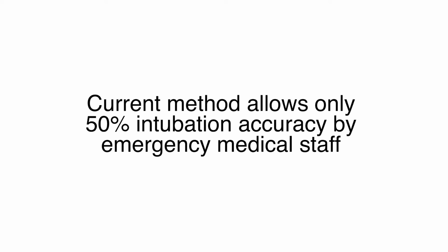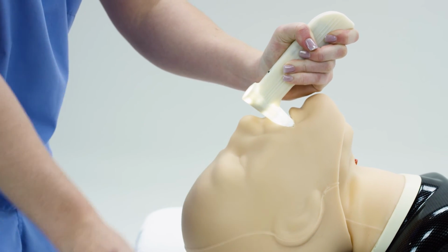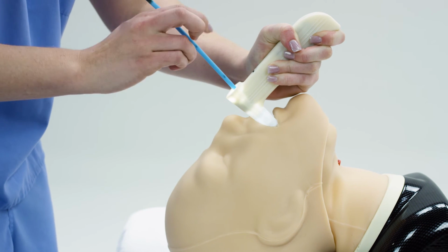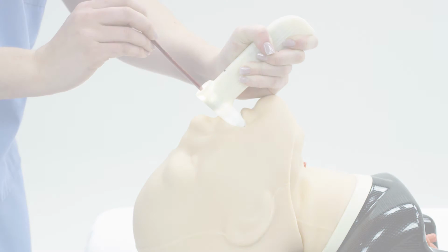in or outside of a hospital. Studies have shown that basic emergency medical staff intubate and place the tube in the correct position 50% of the time. Learning to intubate is not easy, and when the situation becomes difficult, such as with morbidly obese patients or after trauma, oftentimes very inexperienced people are called upon to perform intubation in these most challenging of circumstances, where even experienced providers would have difficulty.